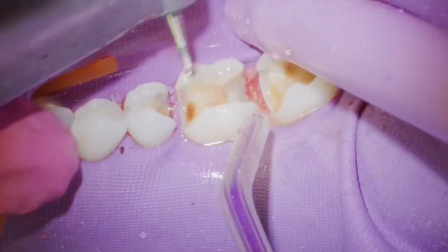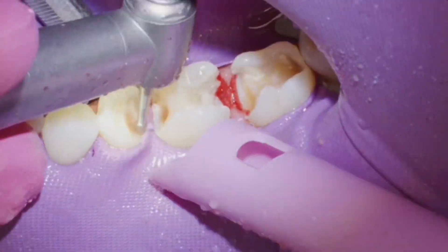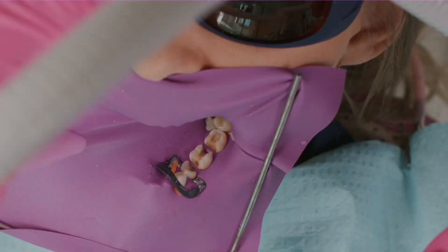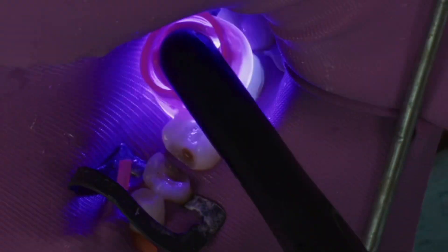The caries go quite sub-gingival in a lot of areas. I'm going to refresh the rubber dam after gross caries removal and get everything super sealed, because I'm going to do some flowable composite bases — you can think of these as just filling undercuts and things like that.